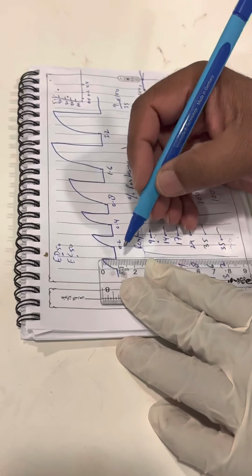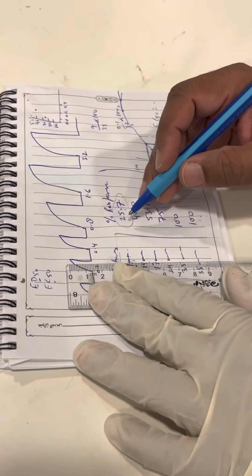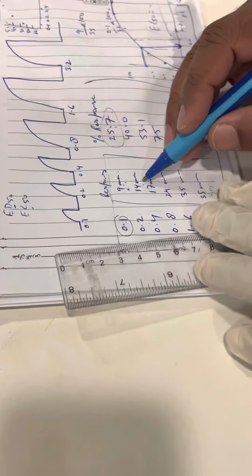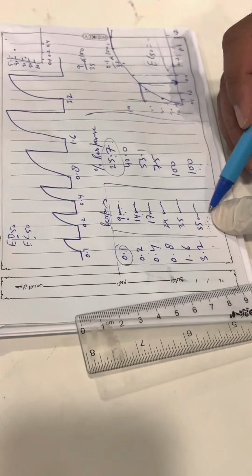As you can see here, it is 9 millimeter. Just write this down as the response. With the 0.2 ml dose, check this one, it is 14 millimeter. Then 0.8, just measure all. The last two responses are 35 millimeter.